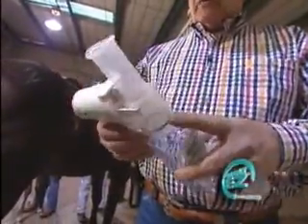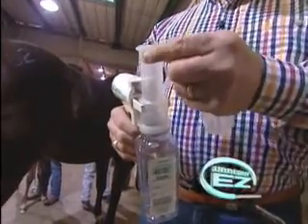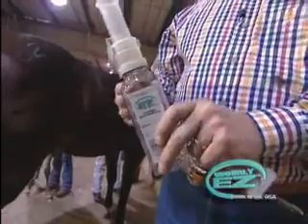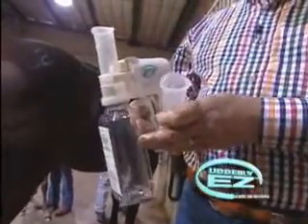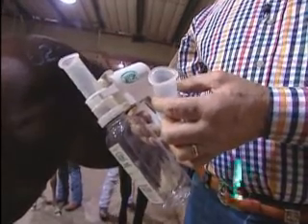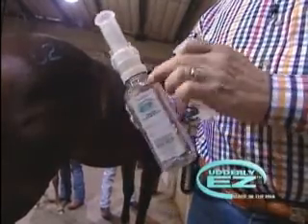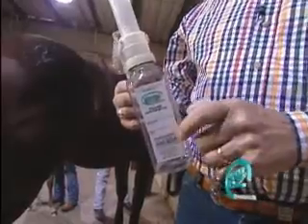Now we're ready to withdraw the colostrum. This is the 60cc syringe size. We tapered the top of it so it fits the bag and the teat very comfortably. It's very rounded on top, soft, so it's totally non-invasive. We have another size that's a little bit larger for those mares that have had mastitis or for the larger draft mares used as nurse mares. This number one size — they're numbered one and two on the front — is the one you use on the majority of mares.